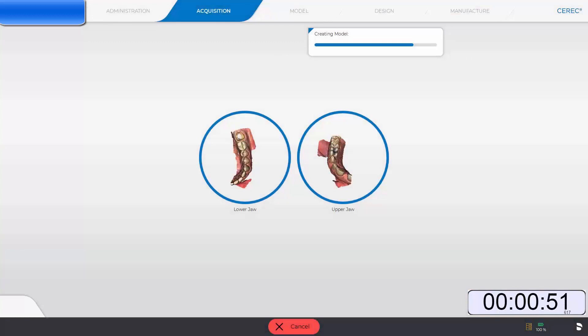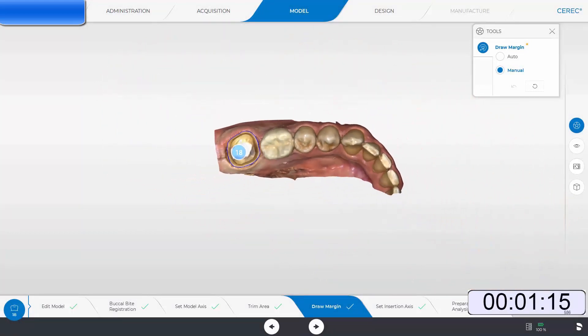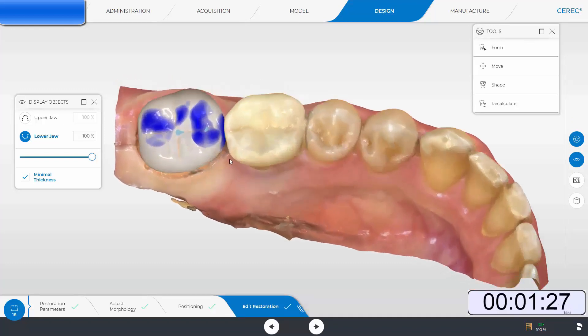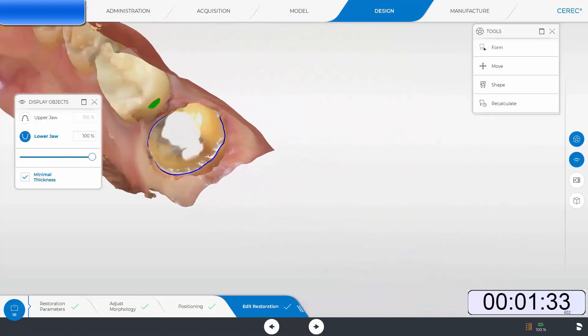The software is only going to take 20 seconds not only to process the highest resolution model, but also set the proper model axis and draw the preparation margin. You can see it creating the model, setting the model axis and drawing the preparation margin. We are now seeing a fully marginated tooth number 18 and we are ready to get our initial proposal. The initial proposal in this case is perfect with no adjustments to occlusion, contour, or contacts. We can evaluate everything and move to the manufacture stage.